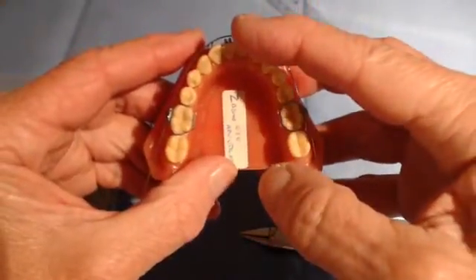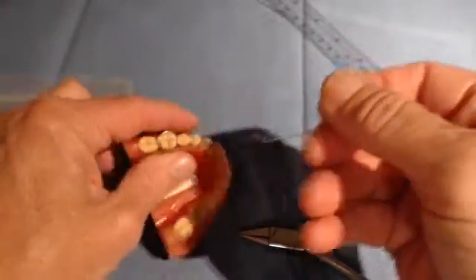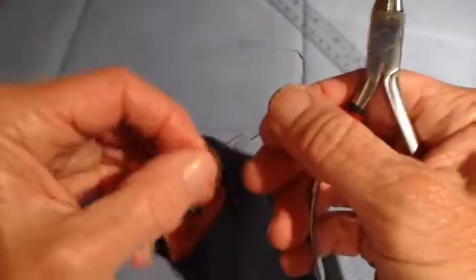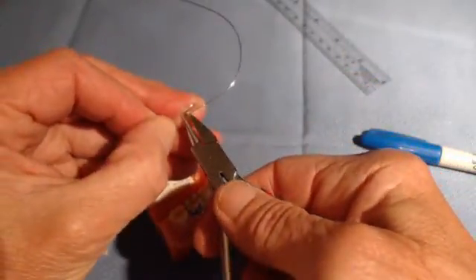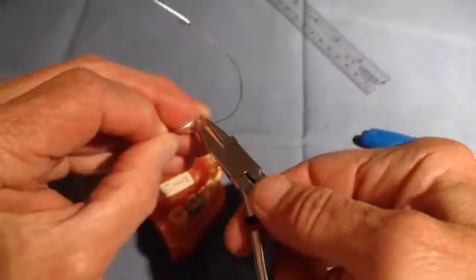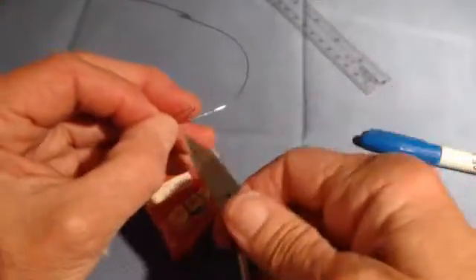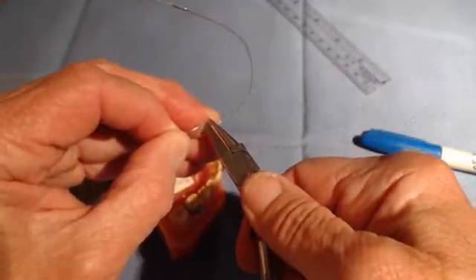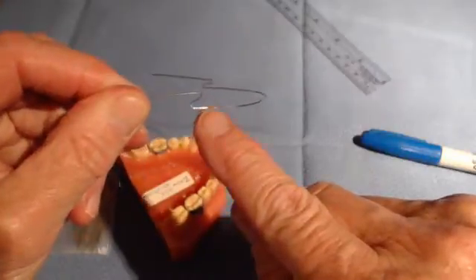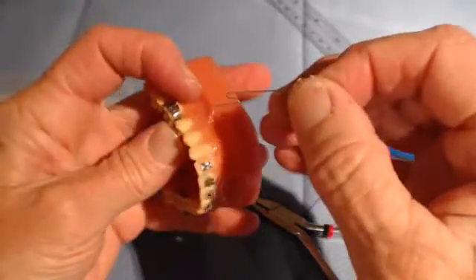Remember, we're trying to advance the incisor to relieve crowding. So let me do a very gentle activation of one side — it's easier if you take the wire out. You will be using up wire from within the loop. Simply insert the square end of the plier into one of those loops and gently squeeze. Insert the square end into one side of that loop and gently squeeze until the ends are paralleled again. You should be able to see that this side loop has advanced patient-right, and this side loop has not.